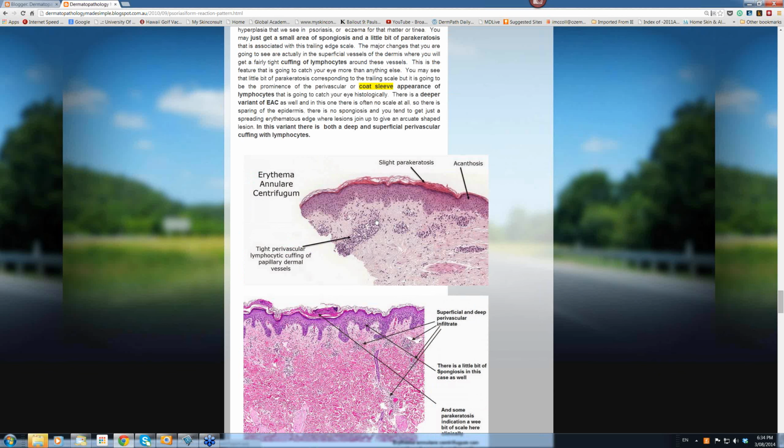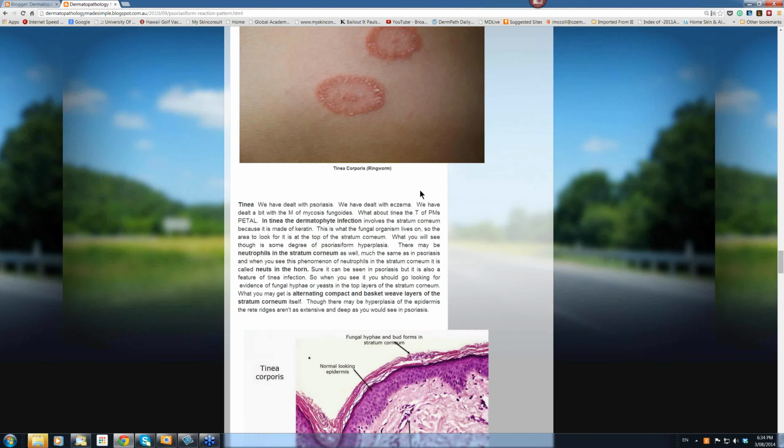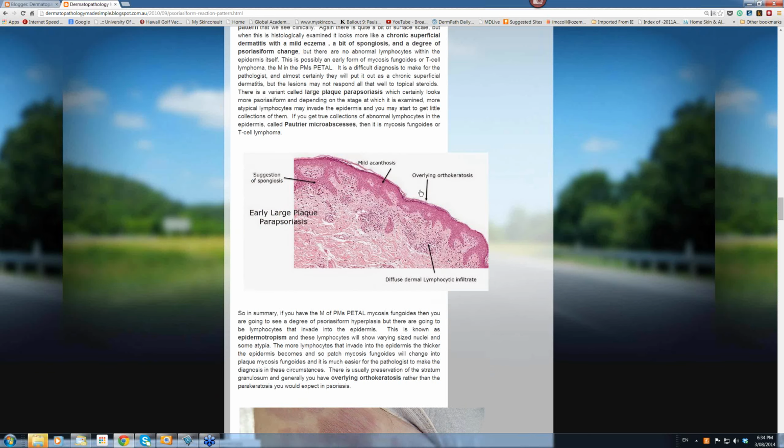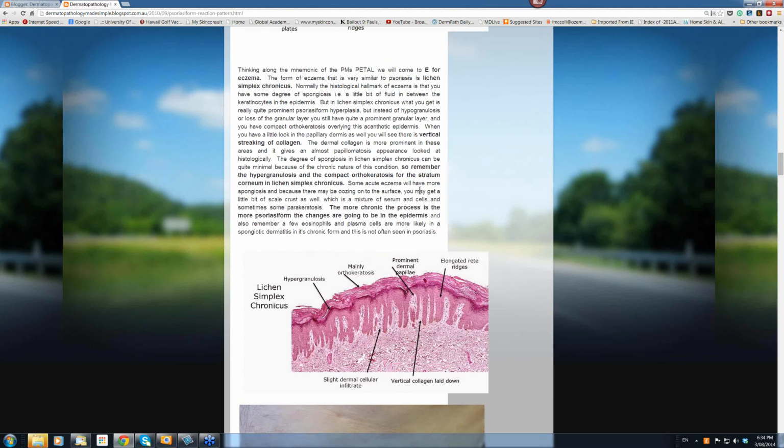So, if you look and the epidermis is made up of very atypical keratinocytes, then you're thinking in terms of malignancy, particularly Bowen's disease and the like, and SCC, keratoacanthoma, etc. We'll come to these later, or we've probably done them earlier on in this series.